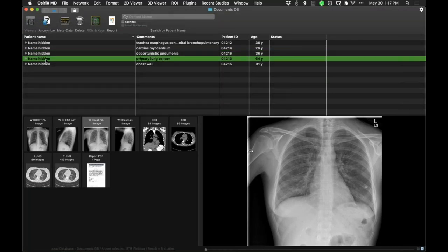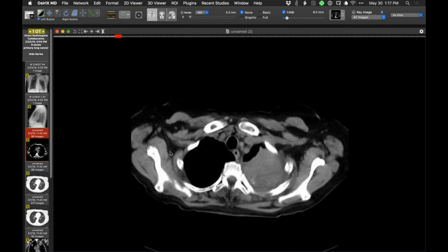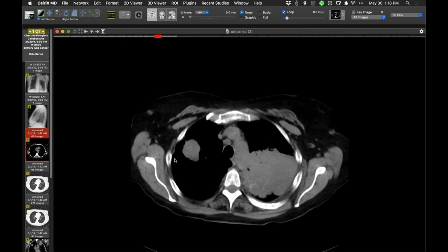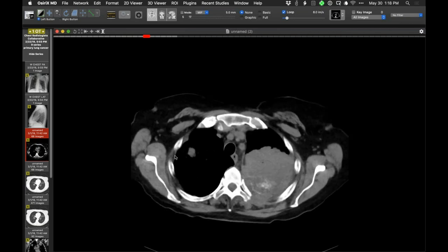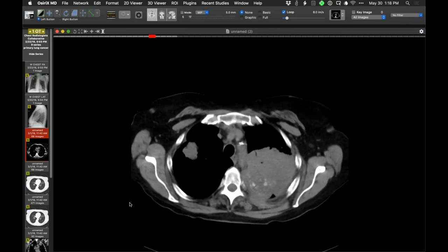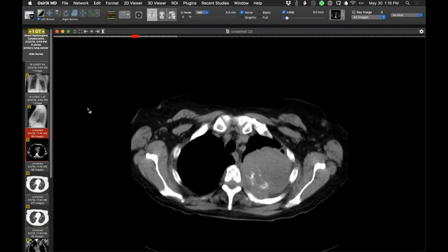Next one is just an interesting example of two primary tumors. The larger one is in the apical left lung, the smaller one relatively in the right upper lobe. It's a really nice example of pathological calcifications - quite large. That can sometimes be an adenocarcinoma. These rather amorphous, somewhat flocculent calcifications are clearly not benign, seen in adenocarcinoma. One can also see that with metastatic carcinomas, particularly mucinous carcinomas. This one unfortunately is metastatic already - it's growing through the chest wall. A particularly nice example of calcifications in adenocarcinoma.